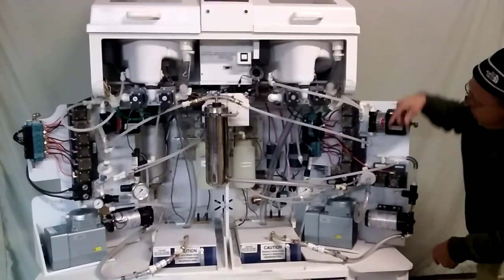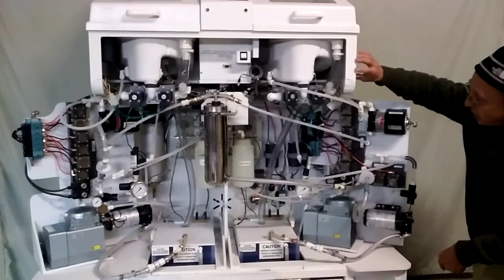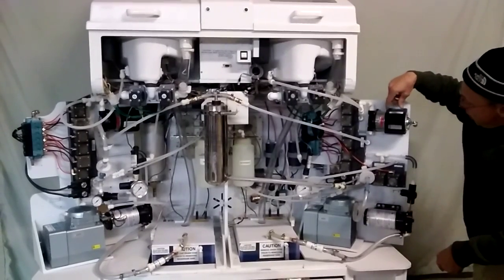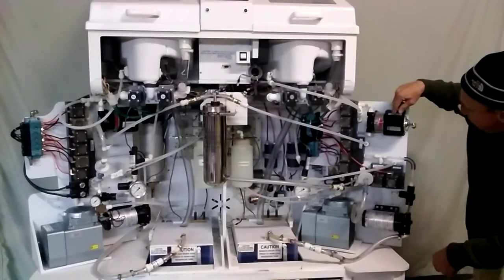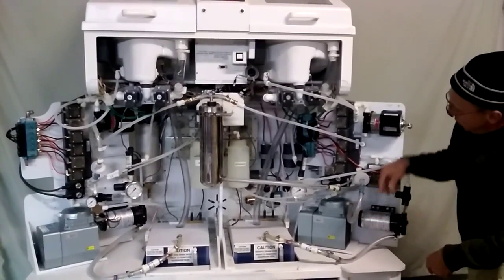And we've taken the A and the B subpanels and we've hinged them onto the case so that you can see all the components, like the recirculation pump, the water valves, the disinfectant pump, the air compressor.